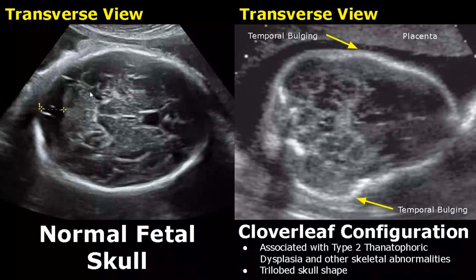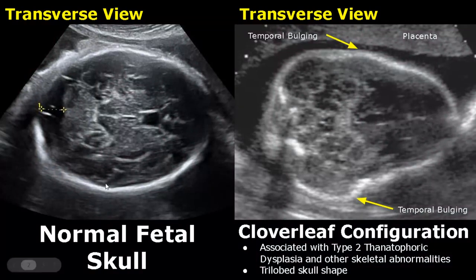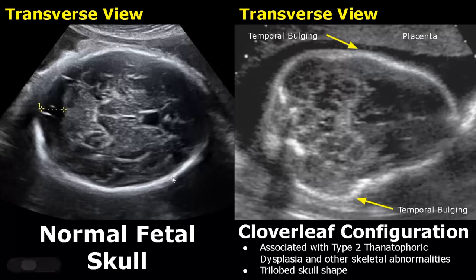The normal shape of the fetal head is ovoid, and the normal calvarium will be hyperechoic — we will see a bright skull. Over here we have a clover leaf configuration, which is usually associated with type 2 thanatophoric dysplasia, but it is also associated with other skeletal abnormalities.